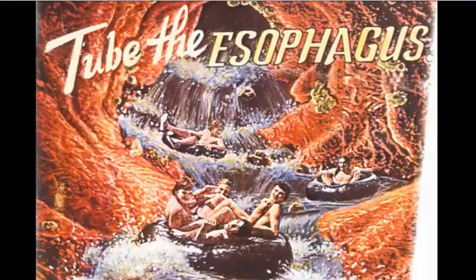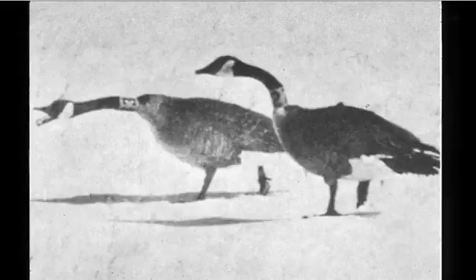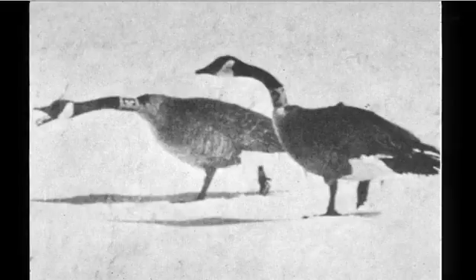All right, so what happens when our clinical colleagues do upper endoscopy and they tube the esophagus? This is the next Disney ride coming up soon in Orlando, I think. Well, we get biopsies from the esophagus. We like to refer to it as the goose. Here you can see the normal goose, and clearly this one is inflamed. And it's really easy to look through a microscope and see an inflamed esophagus, but that's not really the question we're being asked. We're being asked, what's over here on the side out of the picture that's causing this goose to be inflamed? And that's a lot trickier because it requires clinical information, endoscopic information.